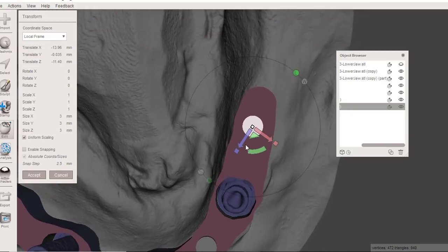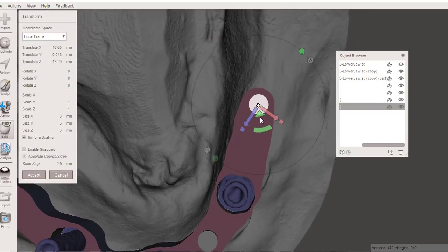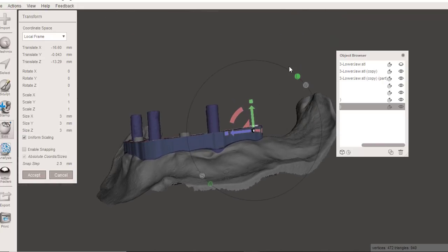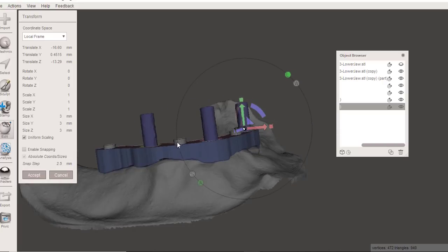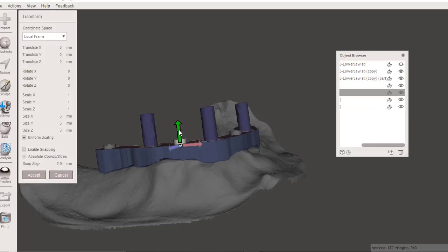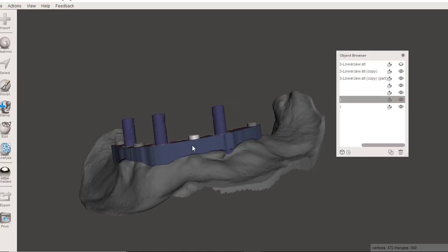So as you can see, we're going from 3 implants, and we're extending back a distal extension on this, and we're going to have 4 locators on our bar. Okay, and if you're worried about any of these not being deep enough, remember you can grab any of the straight sliders. Just don't hit the rotational sliders, because then you lose your parallelism.